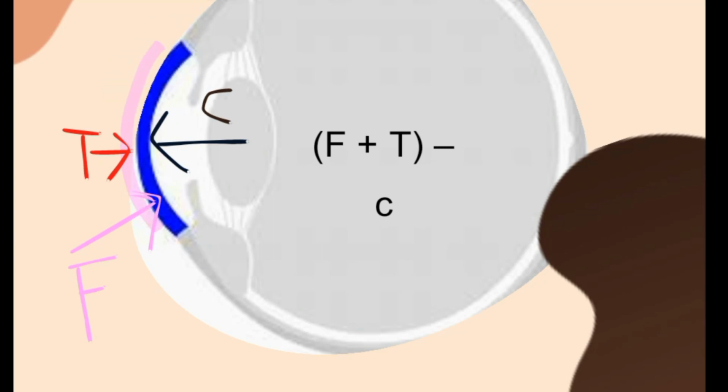Okay, so what I want to say is that the surface of the cornea is aspheric, right? We all know that. Now if the corneal surface is aspheric, can we relate it to the Imbert-Fick law? No, we cannot, because Imbert-Fick law says that it is a dry thin-walled structure. Sphere is a dry thin wall, but cornea is not a sphere. There are two additional forces that are acting onto the surface of the cornea. One is the tear film, right? We all know that the cornea is covered with a surface of tear film.